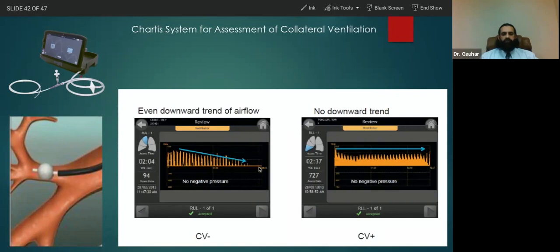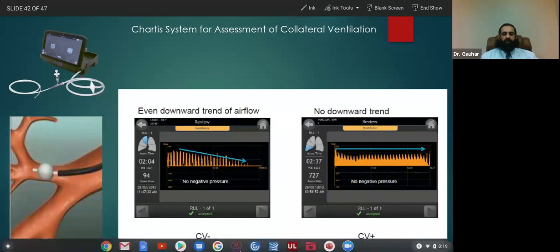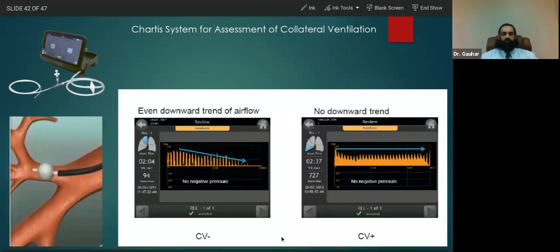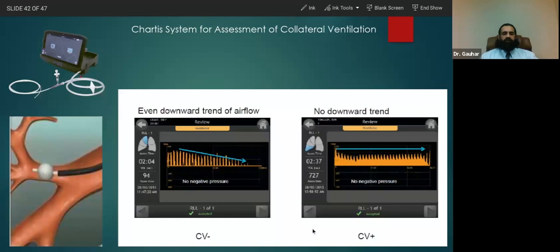Ideally, the airflow on the monitor will continue to decline and go down to zero. This is a collateral ventilation negative situation — it simulates what a valve would do if it were placed. That is the kind of reading we want before we can place the valve.